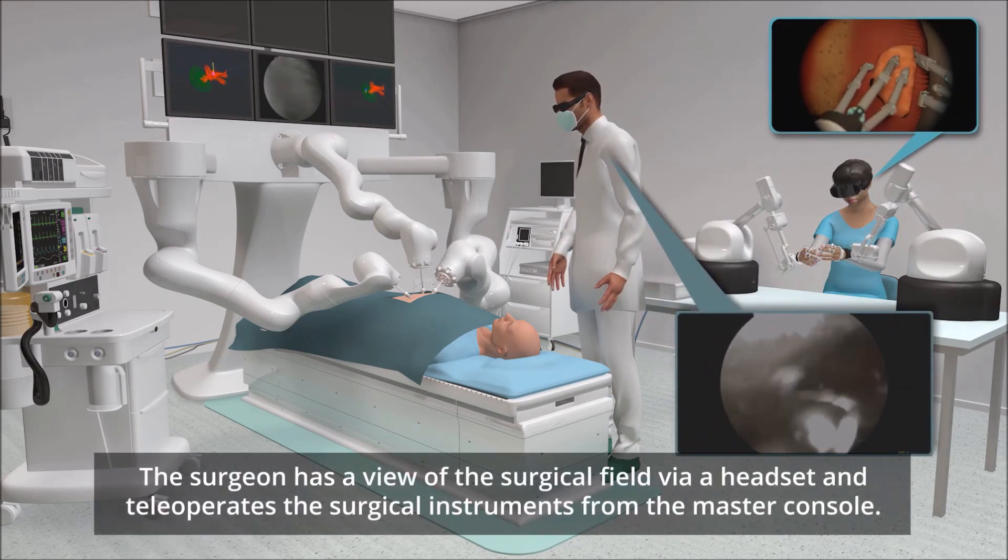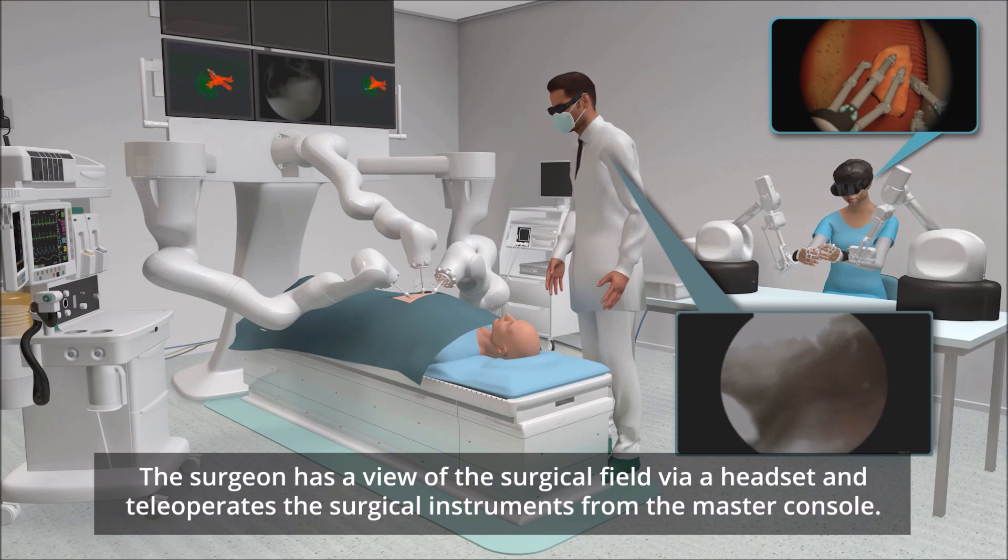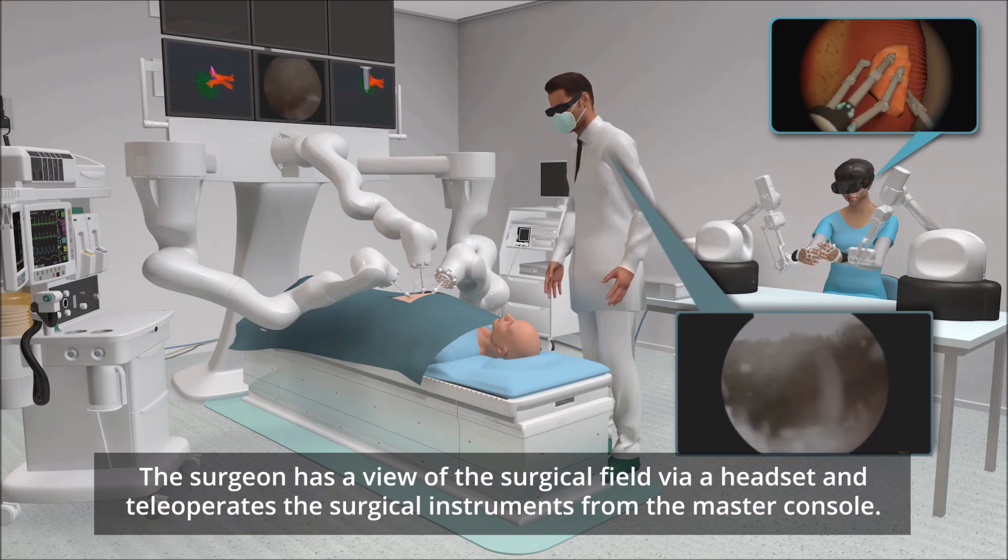The surgeon has a view of the surgical field via a headset and tele-operates the surgical instruments from the master console.